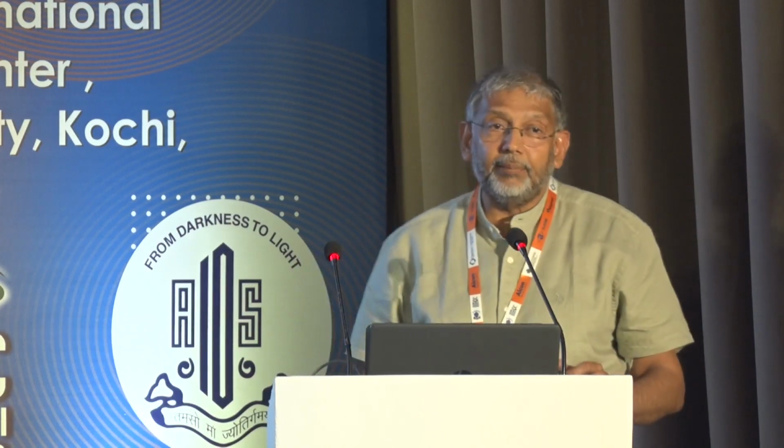This shows that once we are targeting a defocus of 0, or minus 0.5 or plus 0.5, it is better to have a total ocular spherical aberration to the tune of either minus 0.1 to 0 with zero diopter, or when you are targeting emmetropia, or a positive spherical aberration when you are targeting myopia, and a much higher negative, because they act in tandem with the spherical aberration.